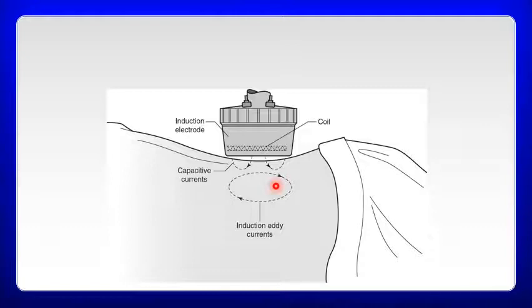So what this does, again, the difference between this and the capacitance technique, and I'll show you some examples of the capacitance applicators, is that the capacitance technique utilizes the body part to conduct the electricity, whereas inductance just places the body part within the current. It places the body within the current. It doesn't actually utilize the tissue to drive the energy through the body, and that's why you get a more comfortable, deeper heating effect with the inductance technique versus the capacitance technique.